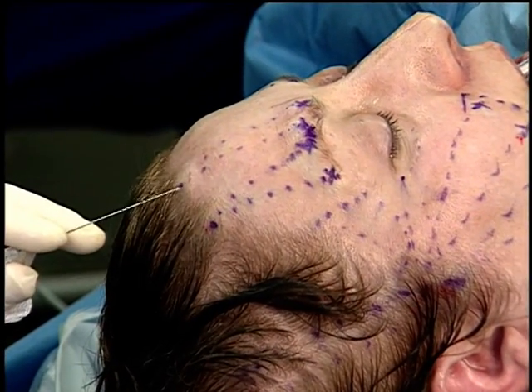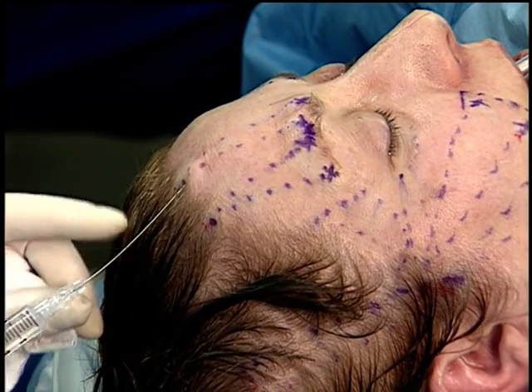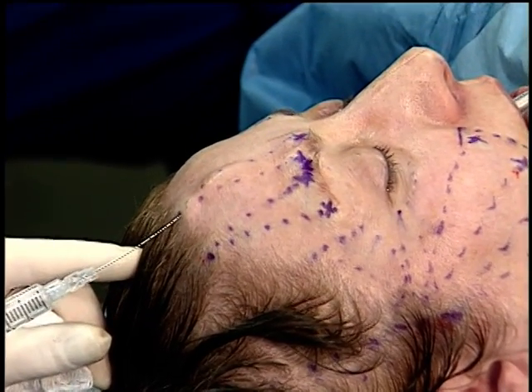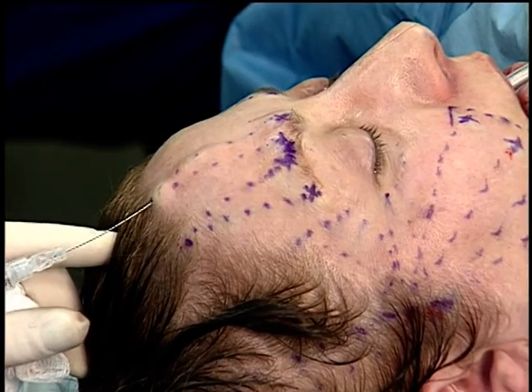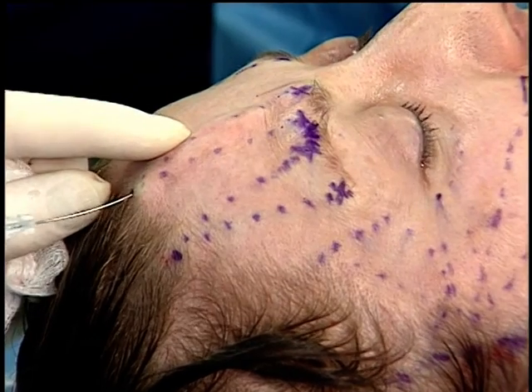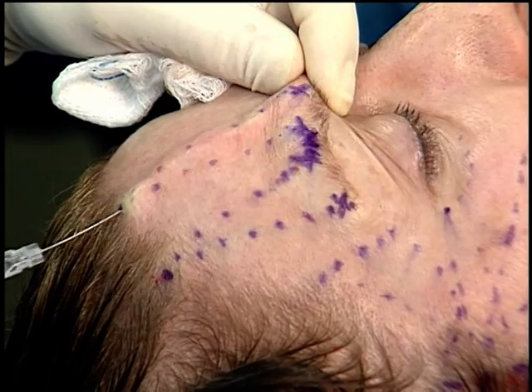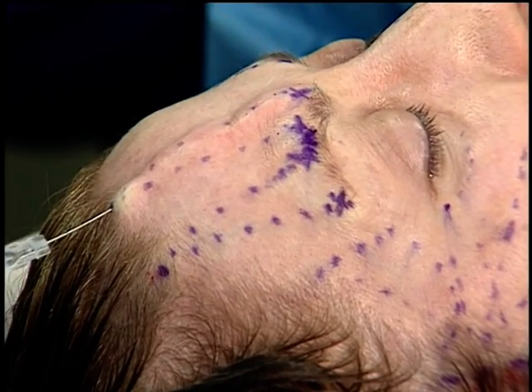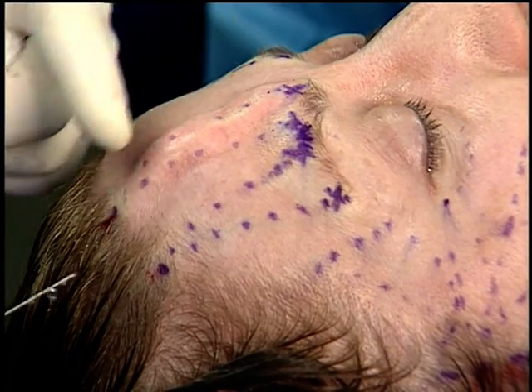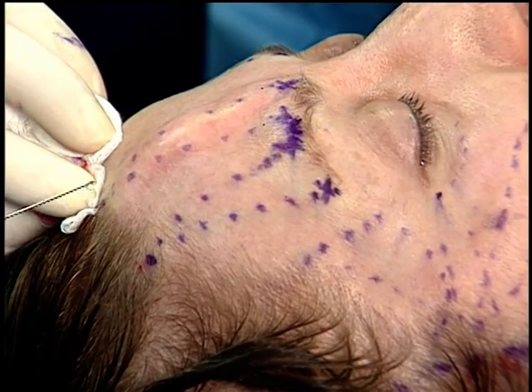I go through my anchor and deployment port, and I find the subcutaneous space. I slightly infiltrate and then advance. I'm in the fat or the galeal plane above frontalis. I infiltrate about 1/10 of a cc before I advance, lifting up the fat and the subcutaneous plane before I advance my needle. I try to get right down to where I'm going to be exiting, and then I infiltrate about 2.5 cc's on the way back. By doing that, you pre-anesthetize before you get hydrodissection and distension and much less pain.